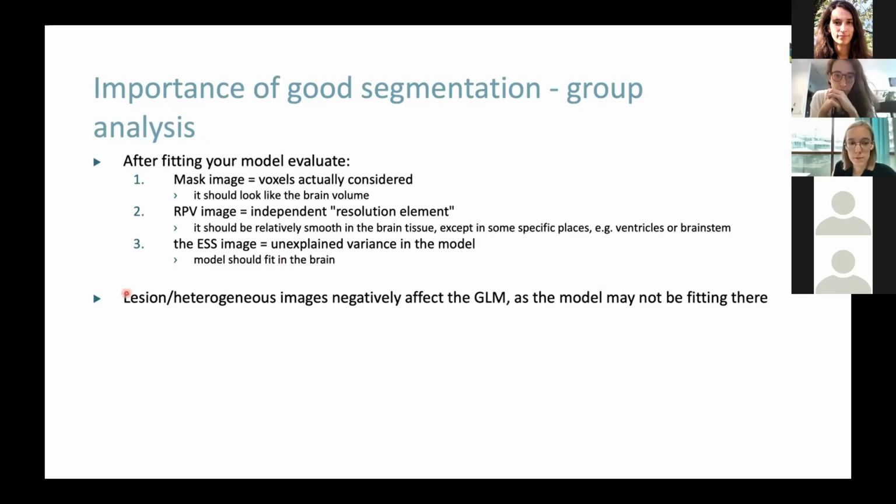And so now I'm pretty sure you know that lesions will negatively affect your GLM model, and for group analysis, you should avoid that.